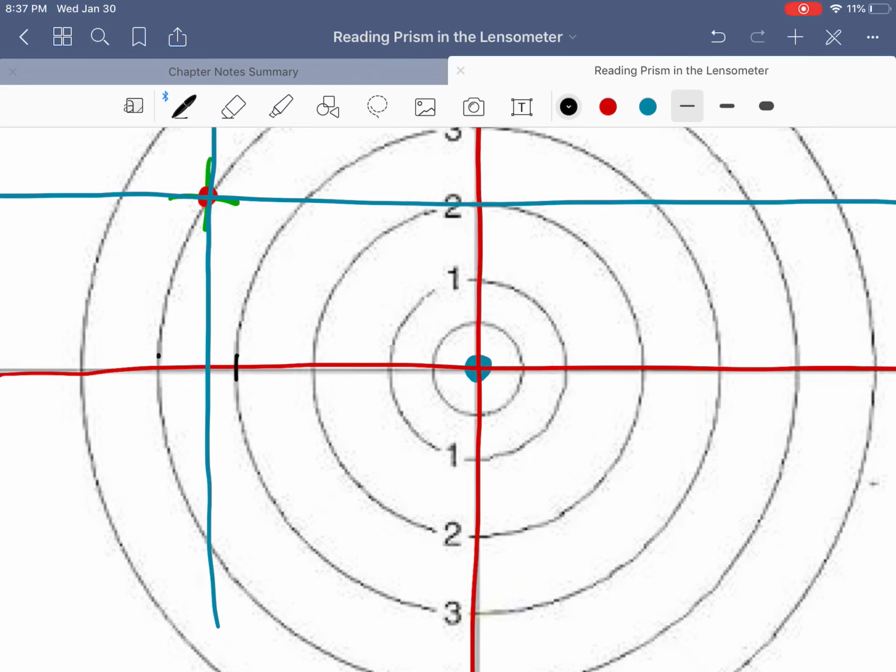So we say, what's the halfway point between here and here? And it falls just beyond where the blue line's coming in. So if that would be 3.5, then we're probably at 3.4.